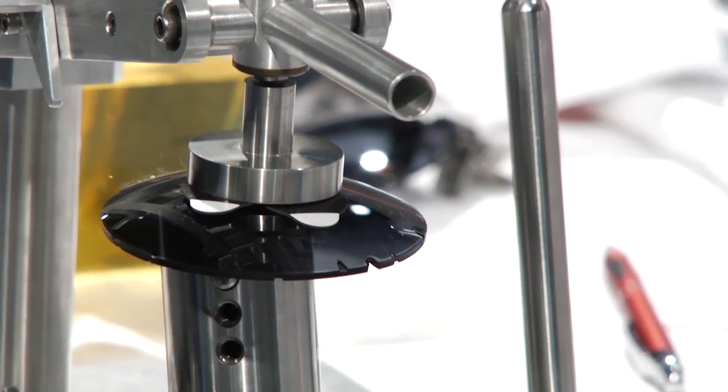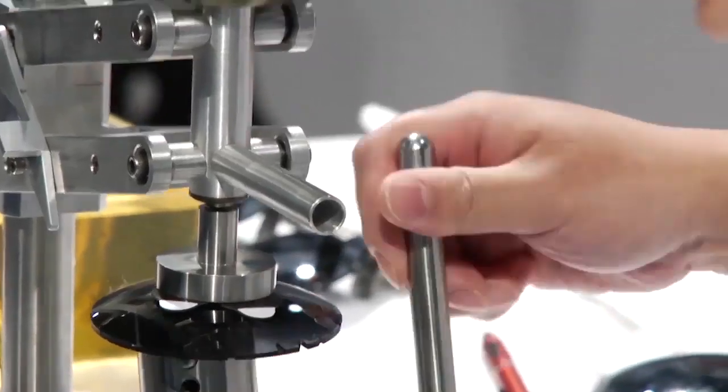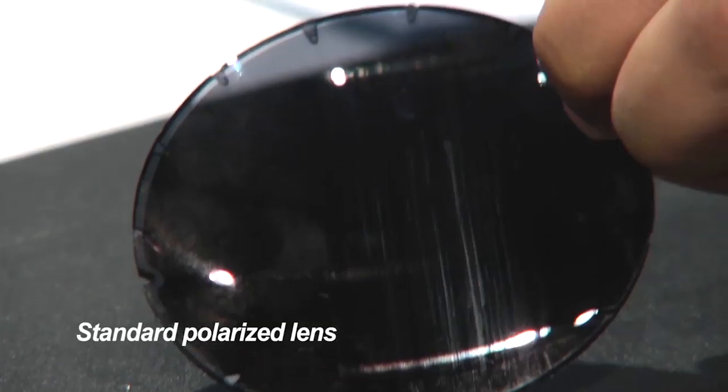I'm going to give it a couple passes — one, two. Son, why don't you give it a few more. Go 15 times. One, two, three, four, five, six, seven, eight, nine, ten, eleven, twelve, thirteen, fourteen, fifteen. Check it out — scratched up pretty bad. No good.